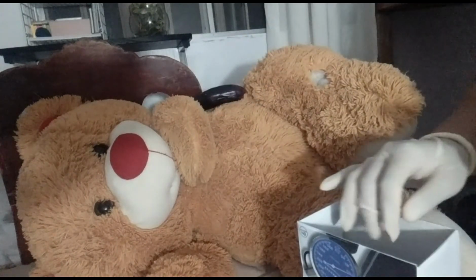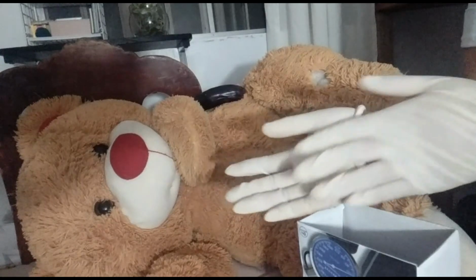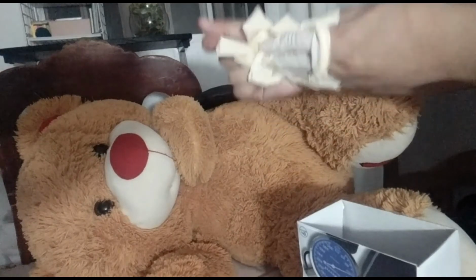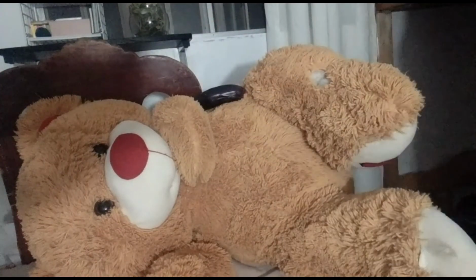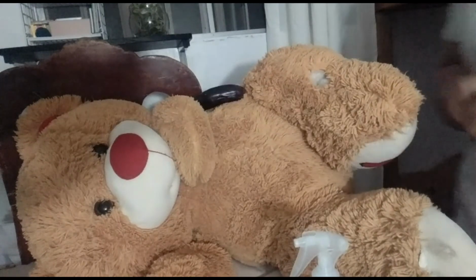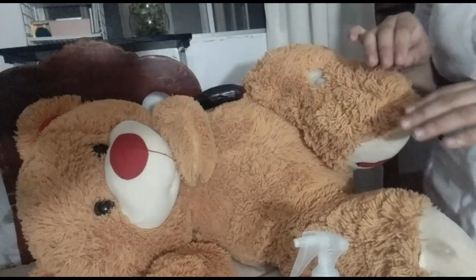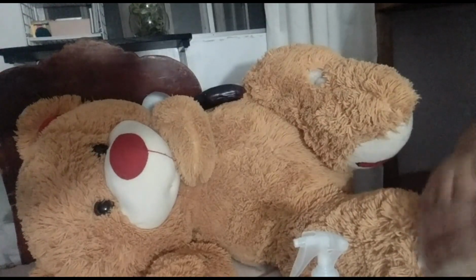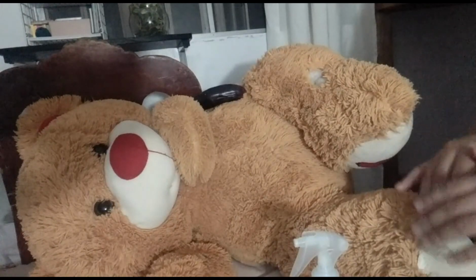After that, I will remove my gloves and now we will perform hand hygiene. I will now document all the relevant information, including the time of administration, drug name, dose, route, and client reactions, and assess the effectiveness of the medication at the time it is expected to act.